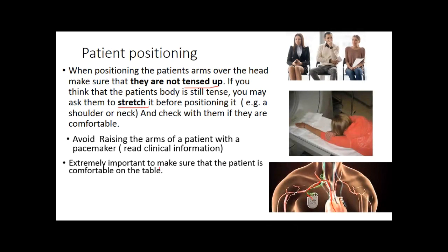So it is extremely important to make sure that the patient is comfortable on the table. Why? It reduces anxiety, and if you reduce anxiety, you are controlling the breathing rate and the heart rate. Eventually, it will also reduce motion blur.